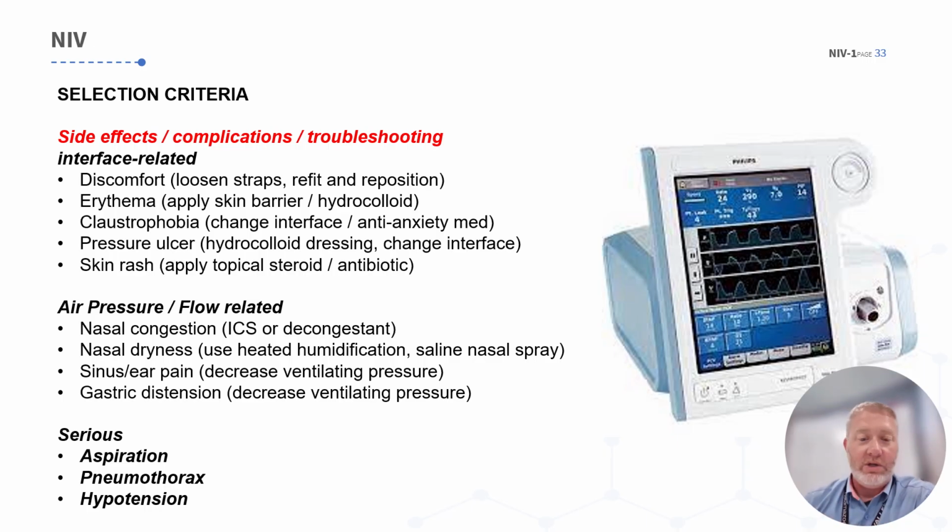And so some of it goes down the one tube into the lungs. Some of it goes down the other tube into the stomach. And so a big thing that we look out for anybody who's on CPAP or BiPAP is their abdomen, making sure that it is not distended or hard or whatever the case.